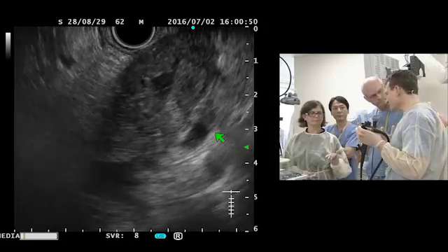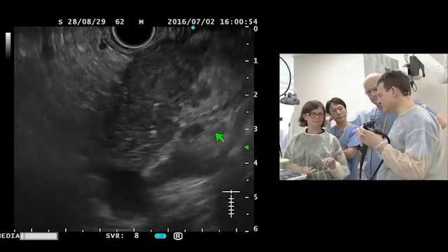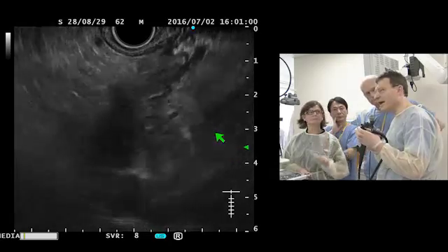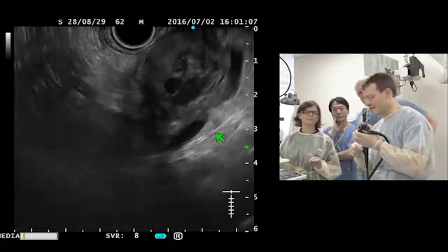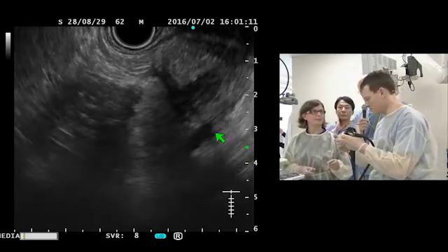My favorite needle is a 25 gauge needle because the diameter of the needle is smaller than the 22 or the 19 gauge needle, and I have less the problem of bouncing back during the puncture. So the smaller the diameter, that's exactly right. The less rebound there is when you place it.